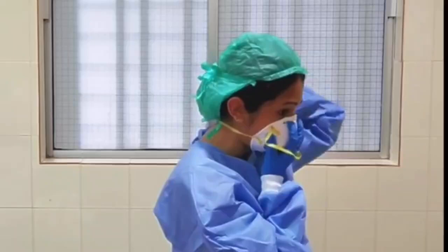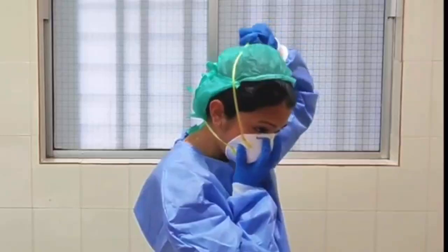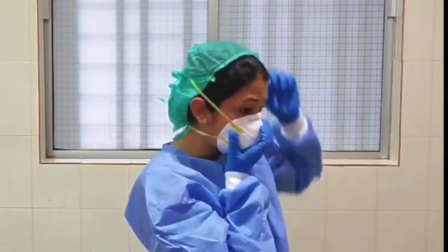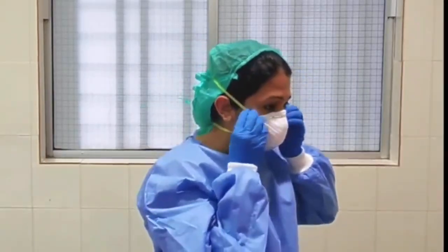Then take the upper tie and place it on the crown, and it should come above the ear.